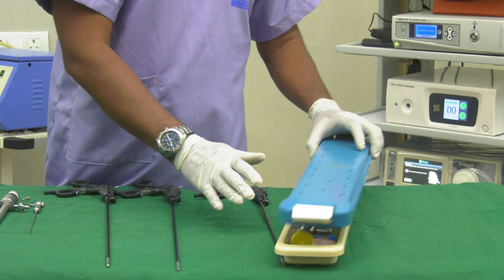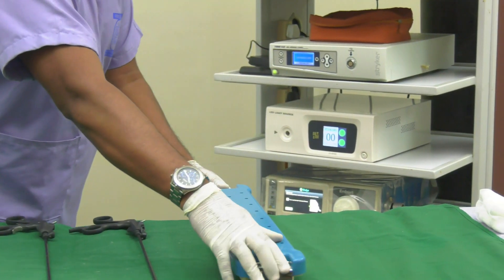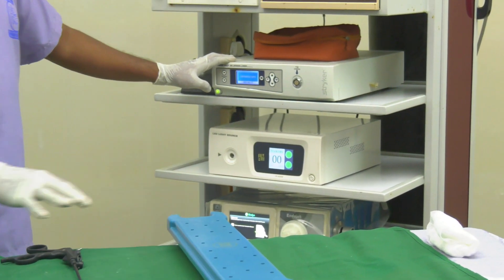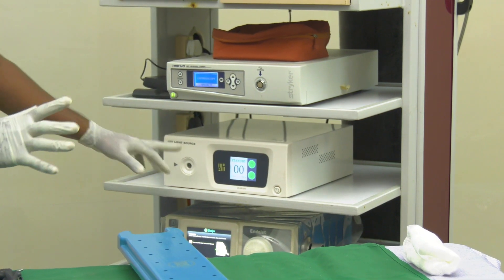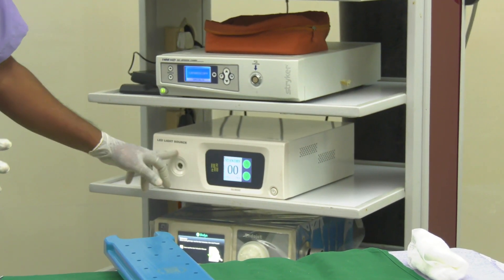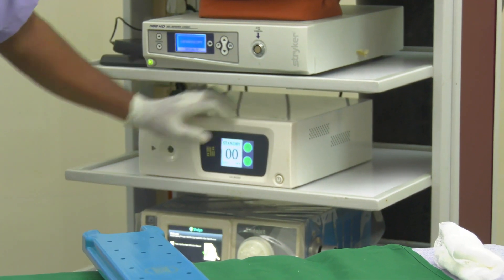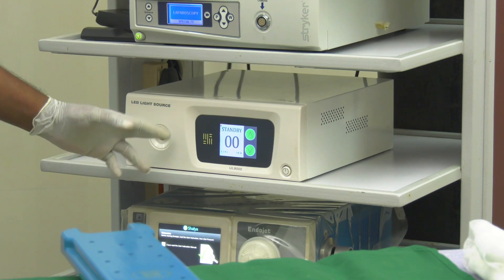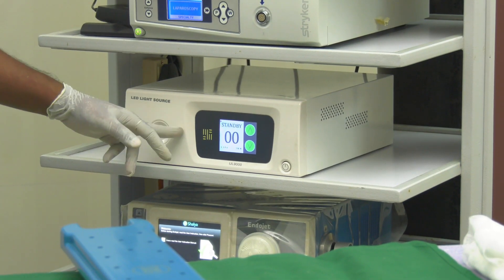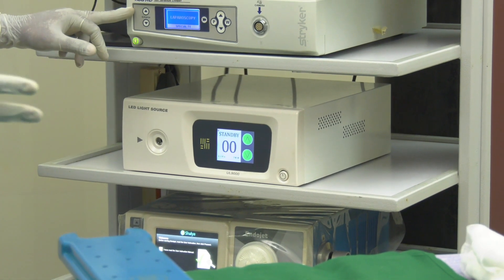This cap is for connecting the camera source — please don't forget that. While doing surgery inside the abdomen, we need light. That is provided by this light source. I can increase the power of the light source as needed. So while operating inside, we have the light source and camera connected through the scope.